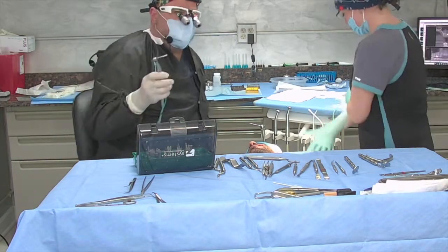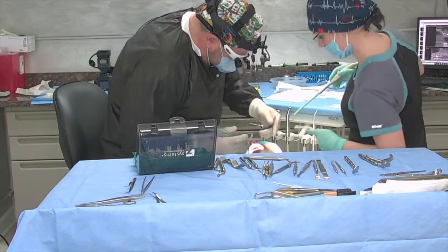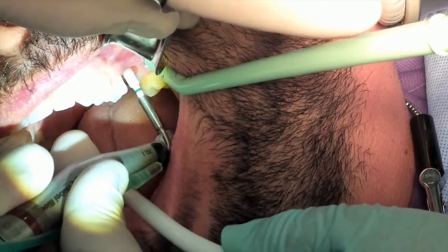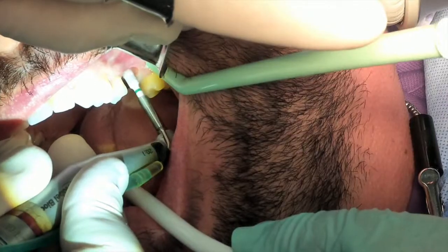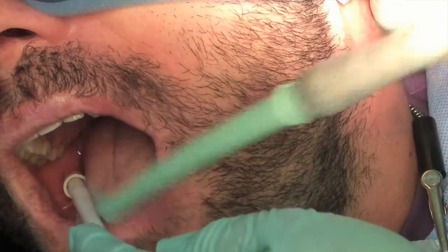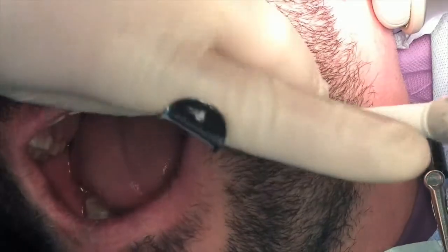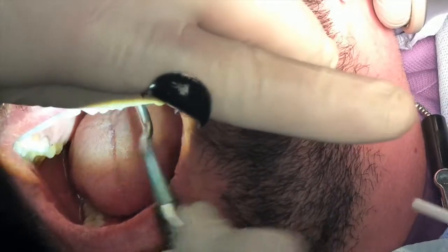So, the 3.75 drill now. I'm going to go kind of quick on these next two. There's 8. There's 10. And look at it, definitive stop. The drill's right at 10. All right. We're going to go to a 4.25. Before I do that, I'm going to go back one more time. I want to just look in my mirror quick. Suction, please. Great. Floor still there. There we go. Perfect. You're right at the 10 line.